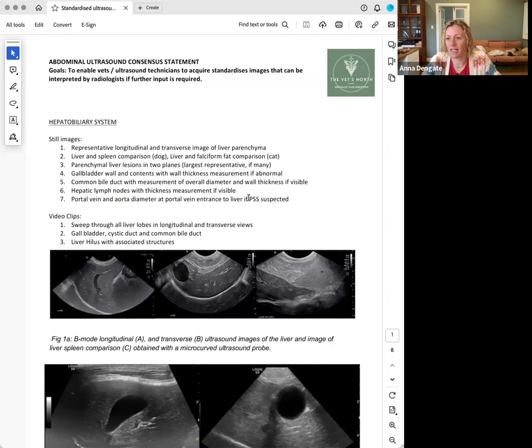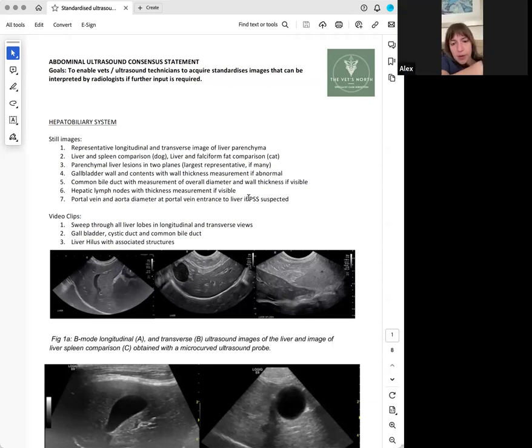So when we're looking at the liver, does anyone have a system for how they approach it? What do you want to assess when you're looking at liver? So I often do the liver at the end of the left side and then do it at the start of the right side. So I'm still thinking of the same organ. First thing I assess is I'll go straight to xiphoid and get a rough idea of echogenicity, gallbladder, and echo texture, but it's very much the first point.